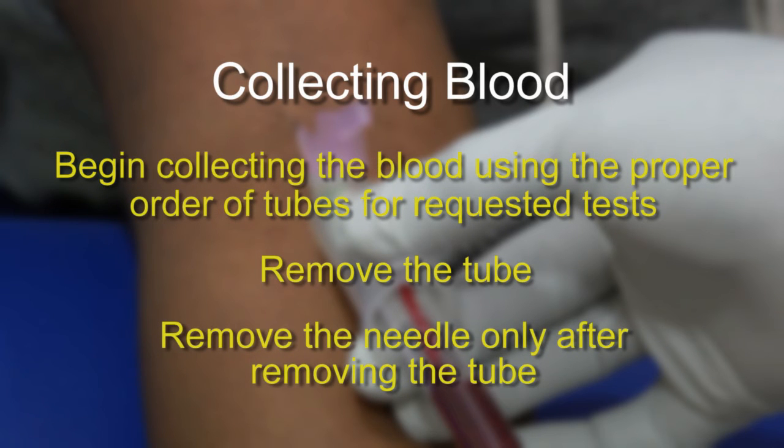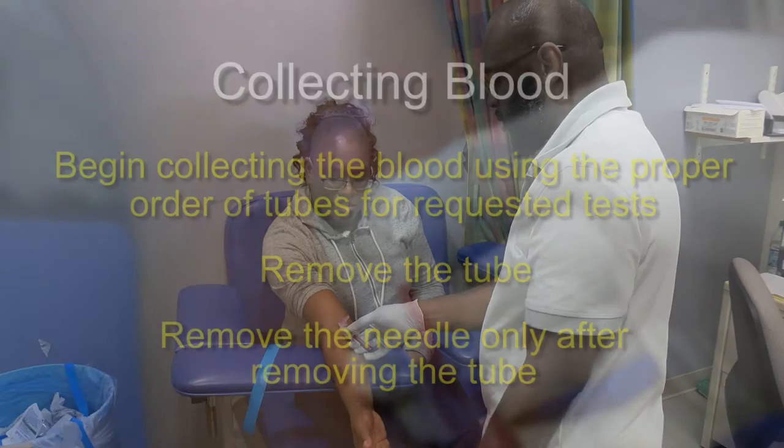Upon removing the tube, remove the needle. Never remove the needle with the tube remaining in the adapter. This can cause some blood to spill out of the needle. Okay.